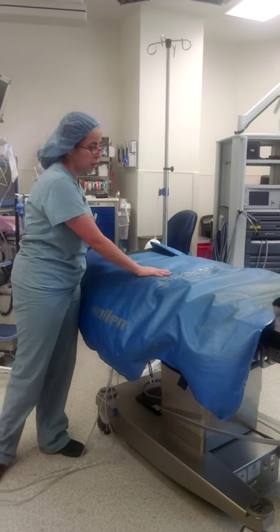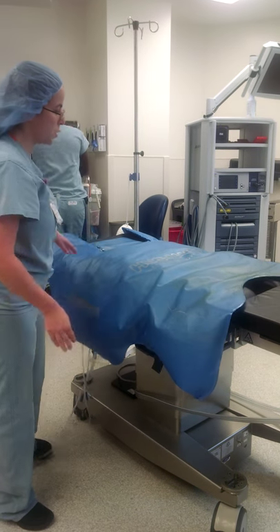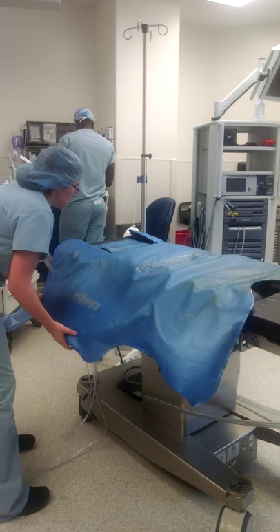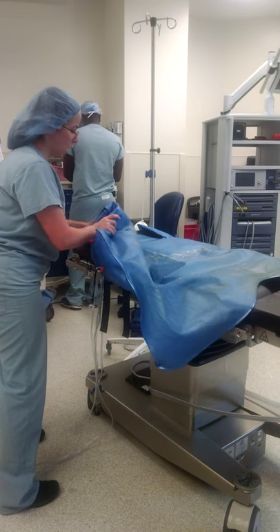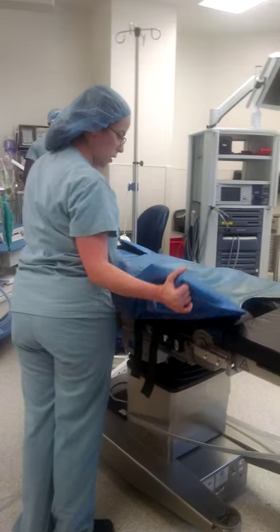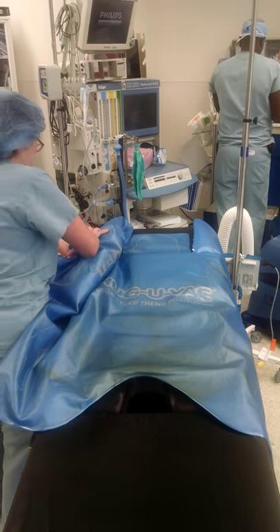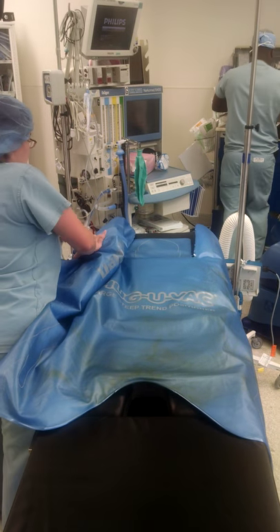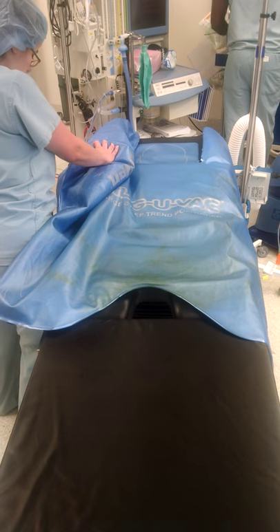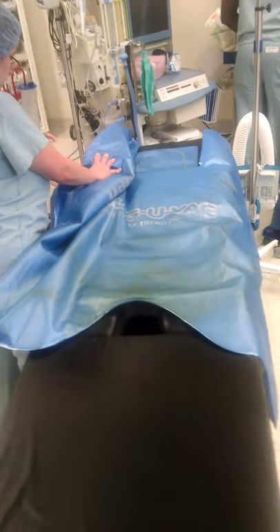If we had a patient on the bed, what we would do is — once you have the patient padded, shoulders padded — you focus mainly on trying to contour this bean bag to their shoulders. Once you get the shoulders situated, you can focus more so down below, kind of holding the hip there. If you have someone helping you, this is not a one-person job. Once you have the bean bag correct on both sides, your helper and you will hook up the suctions.